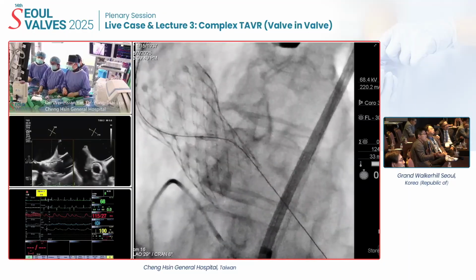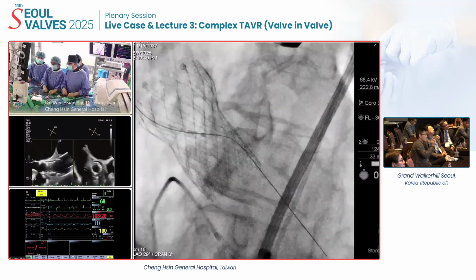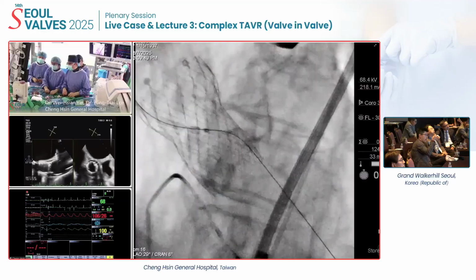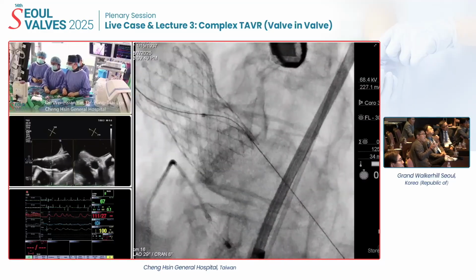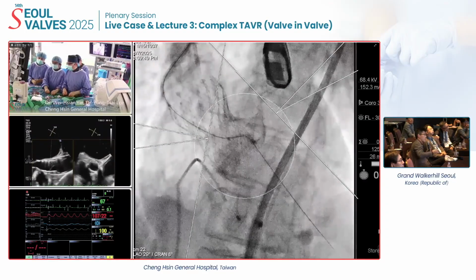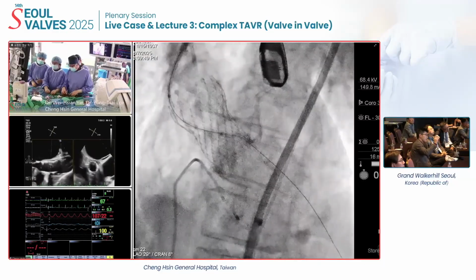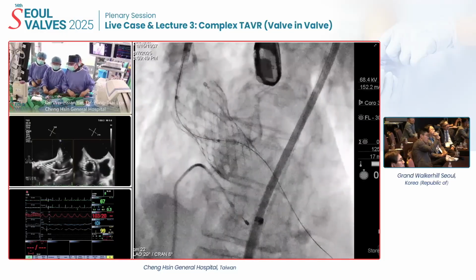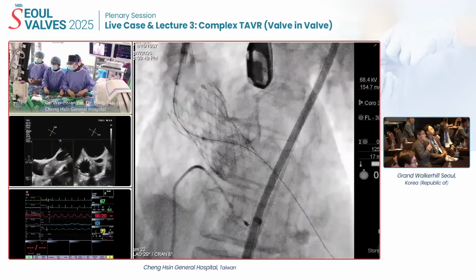As mentioned and as asked earlier, how it could be confirmed is usually using the coronary balloon, after the coronary balloon, the AR is not that evident because the hole is probably still being obstructed by the wire itself. But after using a peripheral balloon, around an 8 to 10 mm balloon, after dilating it, it will cause a large enough hole, causing an AR. And on the TE, and making sure on fluoroscopy, if you see the wire motion is not going into the center, then you really ensure that the wire is within the fenestration instead of really tearing the leaflet before the deployment. So that's how we really assess it.